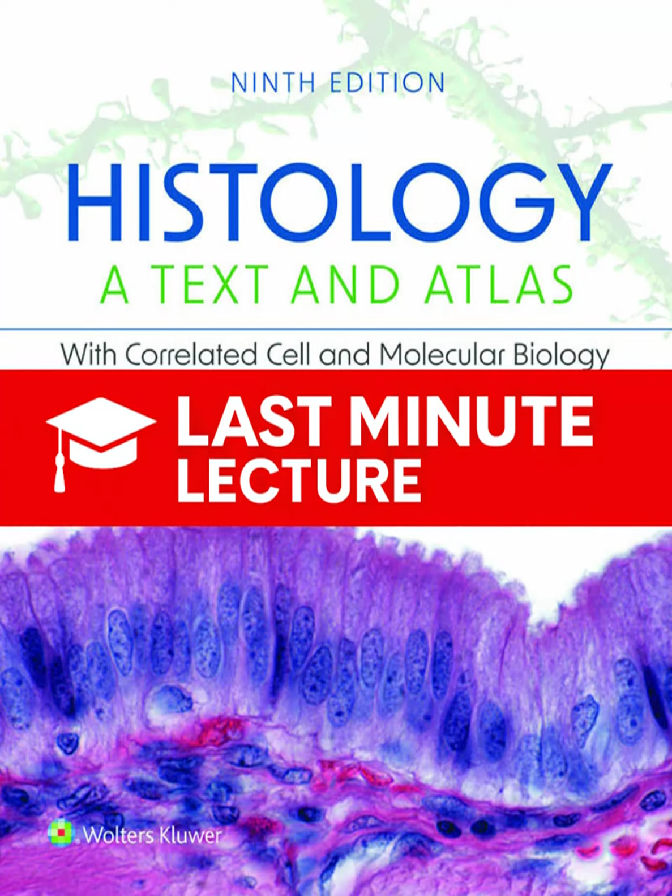Another really common method involves horseradish peroxidase, or HRP. HRP is very popular. Its substrate, which is abbreviated DAB, produces this really striking brown, insoluble product when the enzyme oxidizes it. And that brown precipitate is easy to see. Very easy to see with a light microscope, and it also gives great contrast for electron microscopy. Figure 1.3b shows this beautifully. You can see kidney macrophages stained dark brown using the HRP-DAB method, which makes them stand out clearly against the light blue hematoxylin counterstain.